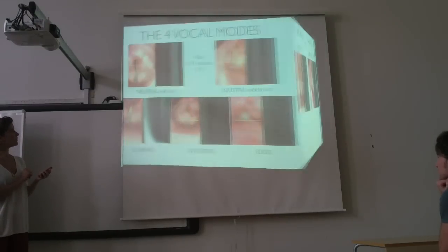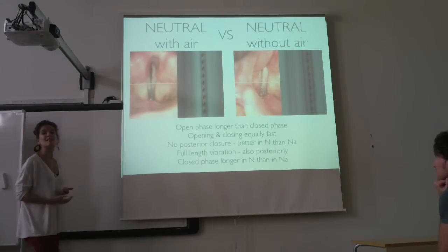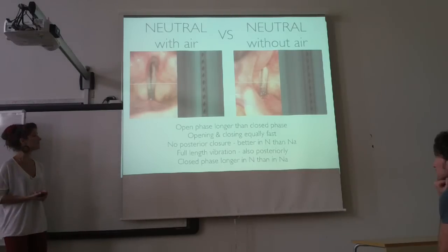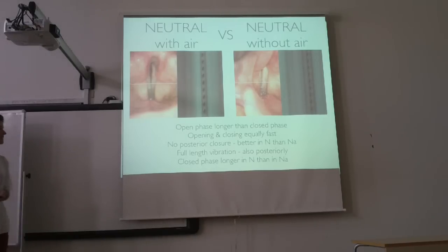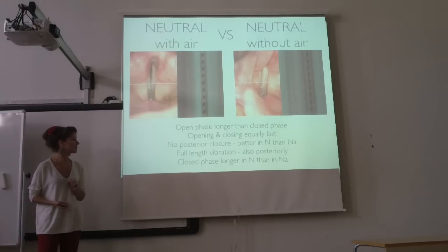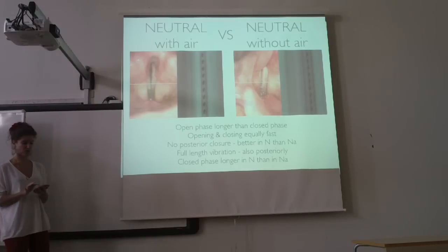So, when we compare neutral with air and neutral without air, this is what we see. The open phase lasts longer than the closed phase. The opening and closing of the vocal folds is equally fast. There is no posterior closure, although in neutral without air, it's better than in neutral with air. There is full length vibration, also posteriorly, where the vocal folds don't close. And the closed phase lasts longer in neutral without air than neutral with air.